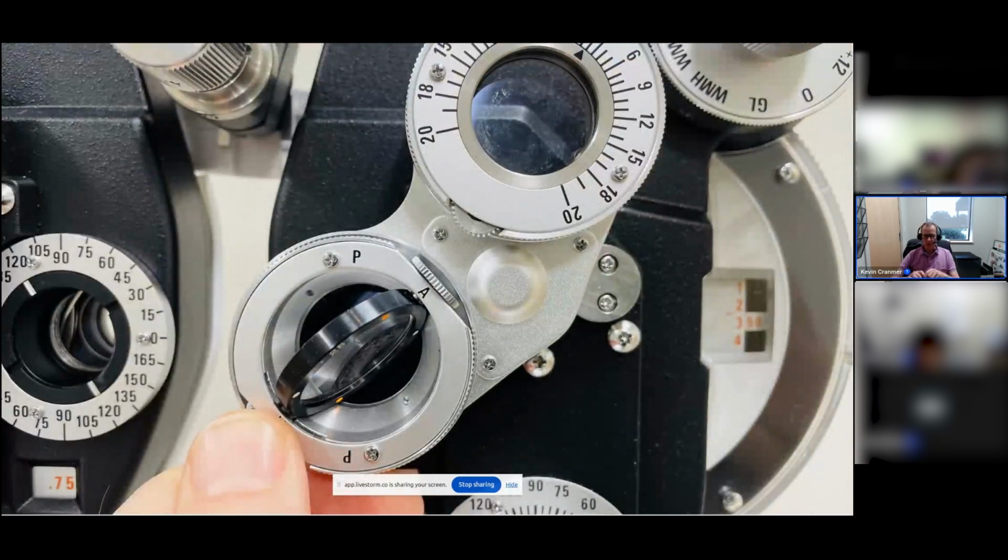So now you can flip this lens back and forth using those knobs, and those red and white dots will flip position. In one case, when you flip it, the lens will have the orange dot on the counterclockwise position of the A, and flip it again, it'll be on the clockwise position of the A.